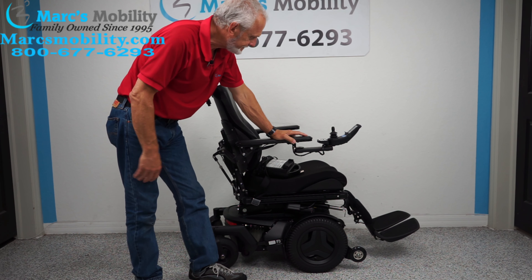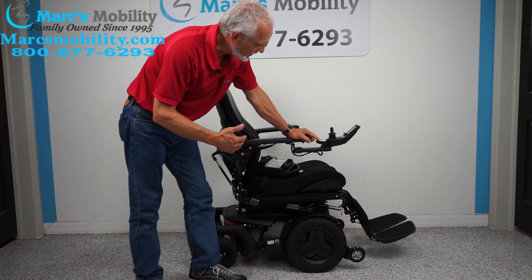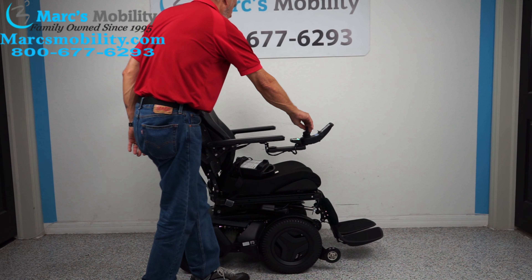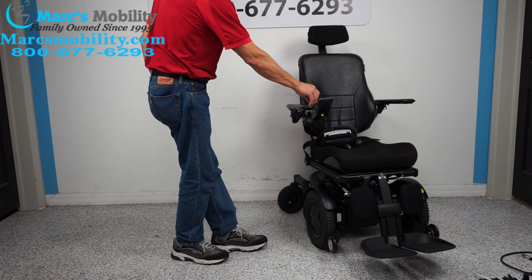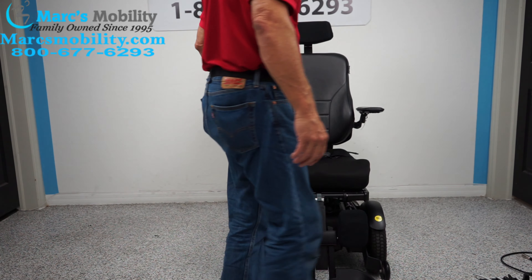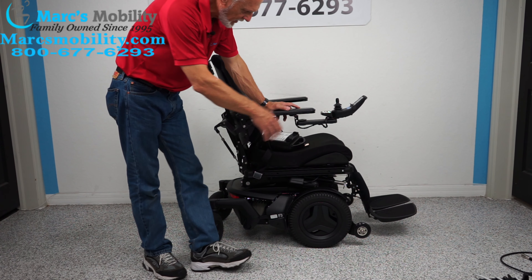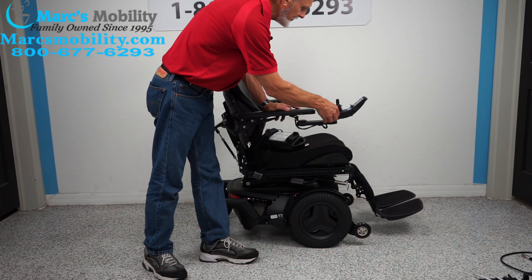We're going to turn the power back on. I'm going to bring the legs in right now. So if you're in the house, bring the legs all the way in like that, and then you can just turn in a circle. This chair will turn in a complete circle the way it is. If you're outside, leave your legs out like this for more clearance.